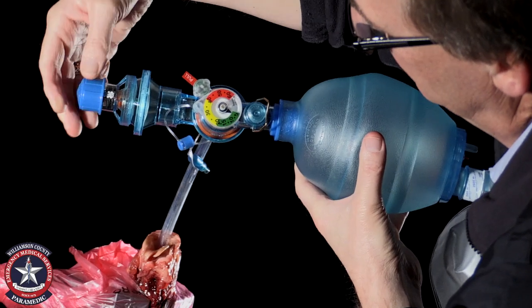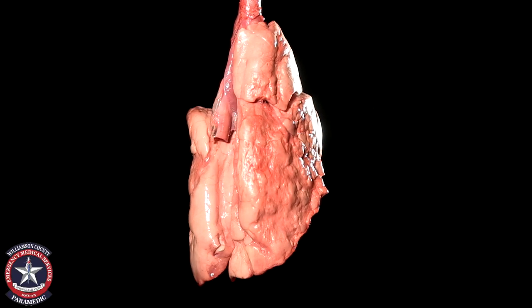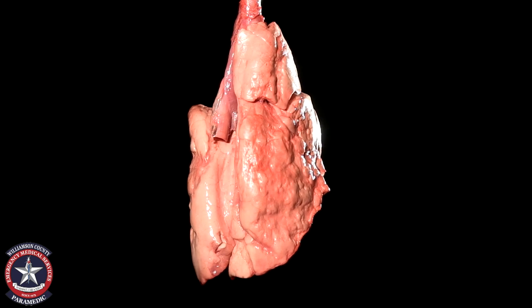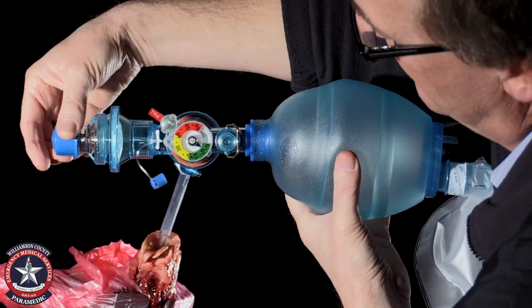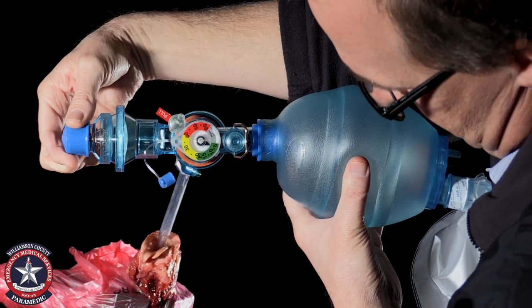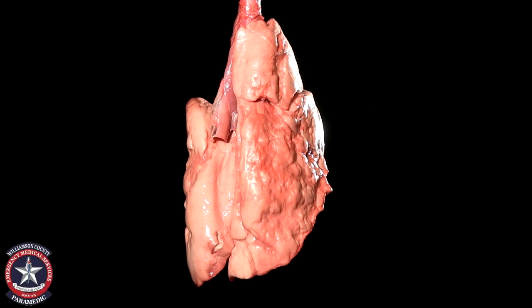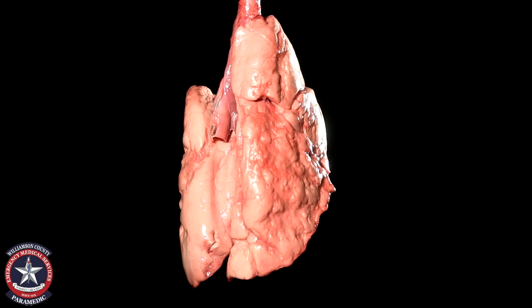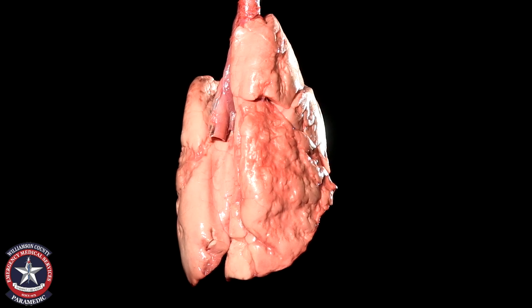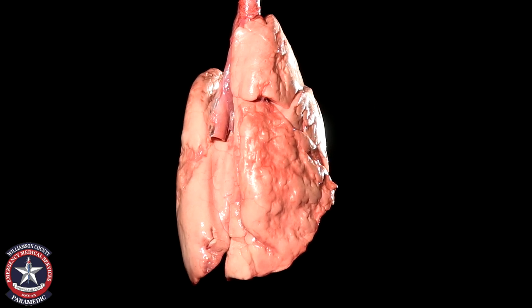Now I'm going to go up to fifteen of PEEP, and now twenty — I'm going to turn the PEEP all the way up. I want all of the PEEP.